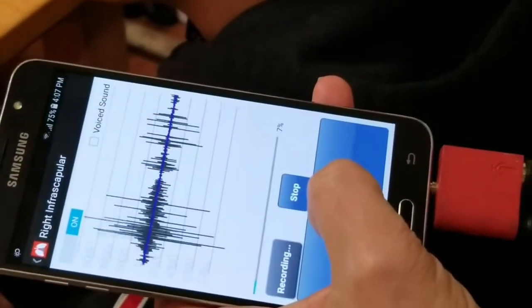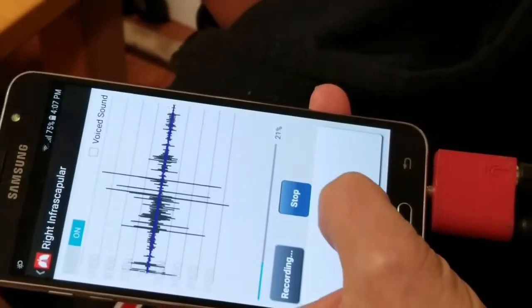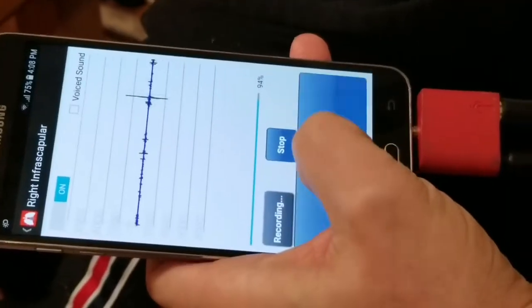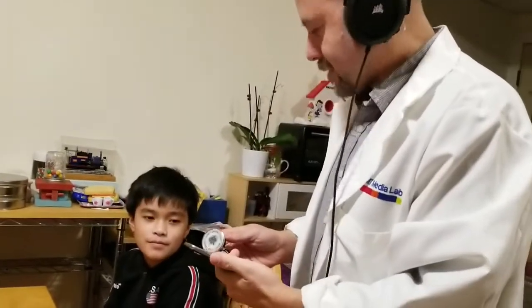Okay, take 5 deep breaths, please. In and out. In and out. In and out. In and out. Okay, good. And then the last thing I want to do is record some of your cough sounds, okay?